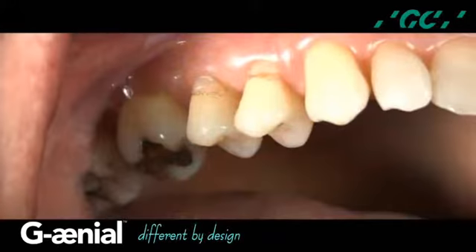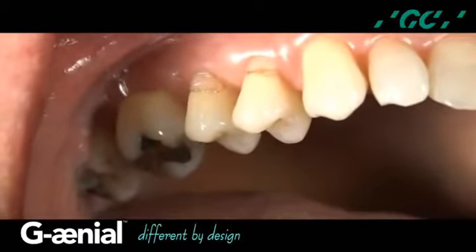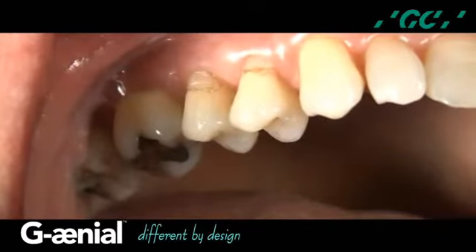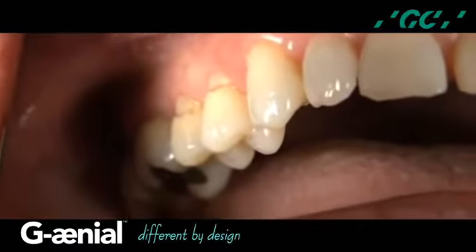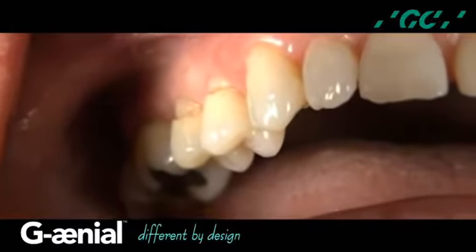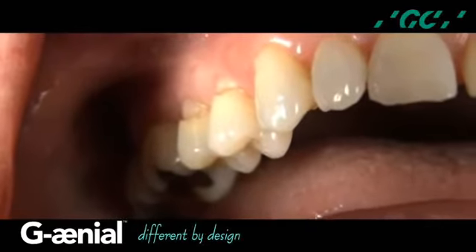These repeated flexural forces can cause adhesive failure of cervical composite restorations at the dentin-resin interface, which can result in microleakage, partial or complete debonding of the restoration. Therefore, an occlusal equilibration is performed to eliminate the premature occlusal-deflective contacts.